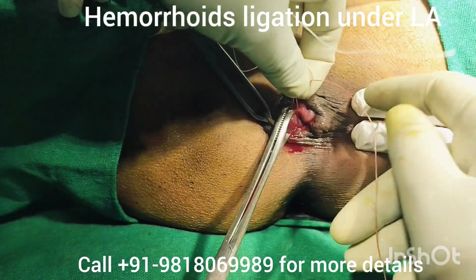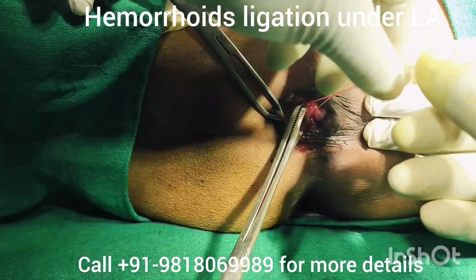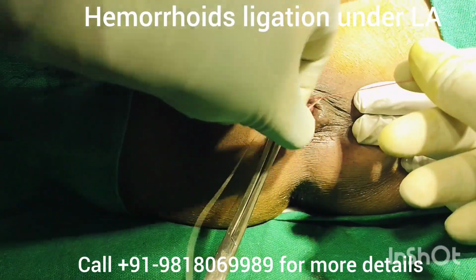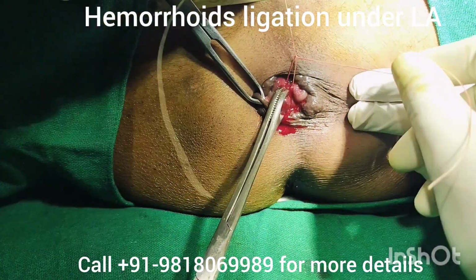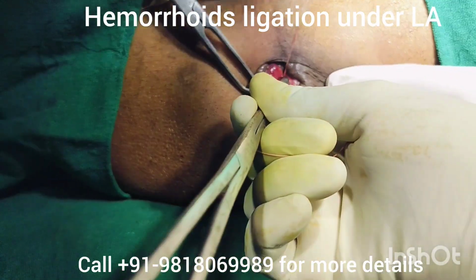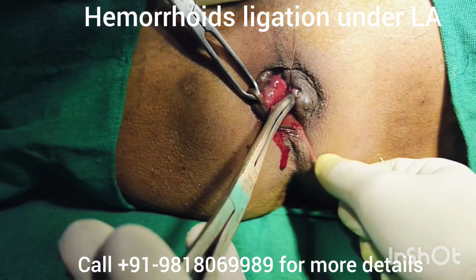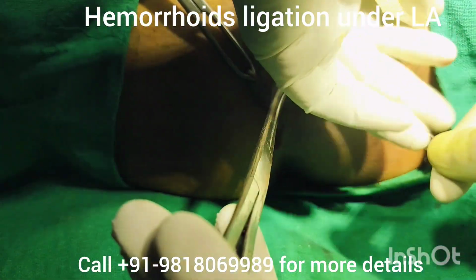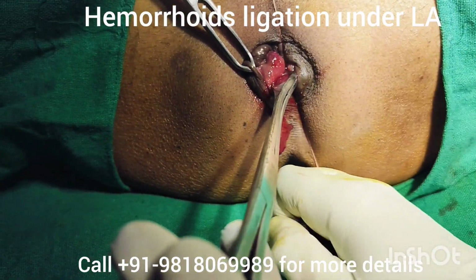This transfixation will cover blood vessels, hemorrhoidal artery as well as vein, and we have to strangulate this pile mass through this ligation. This first knot has been placed medially and this knot has been secured.